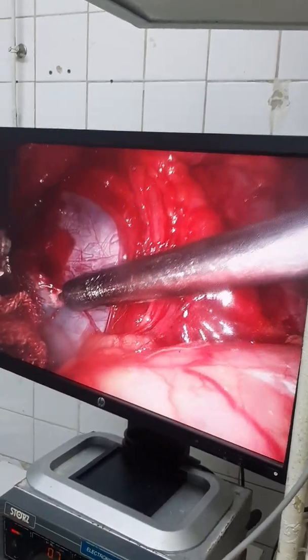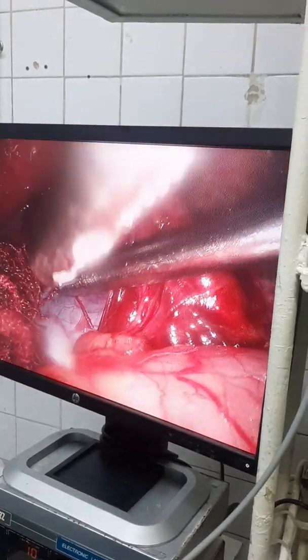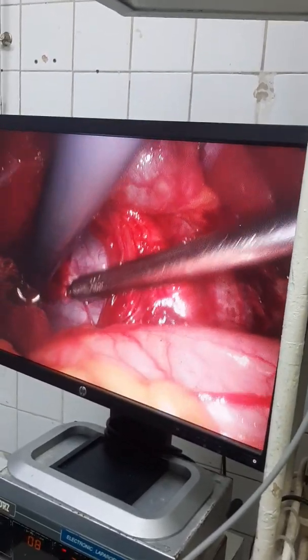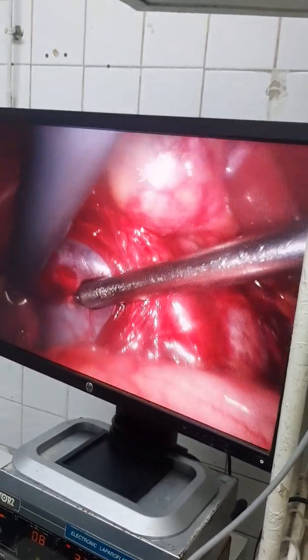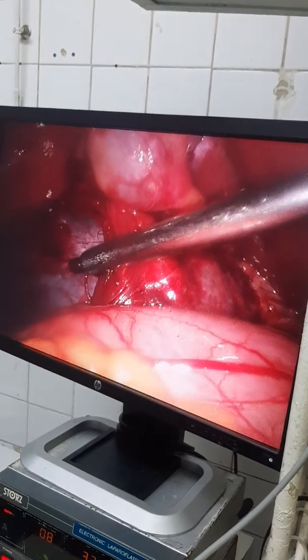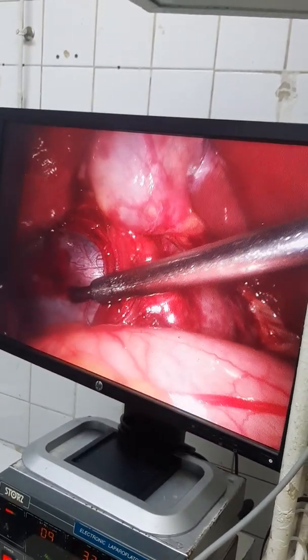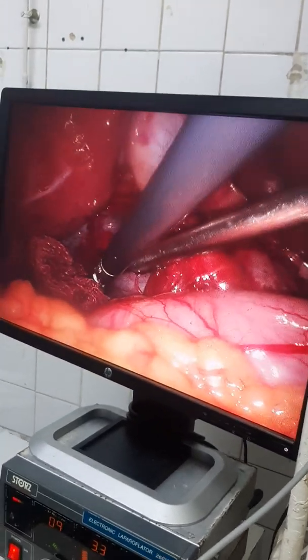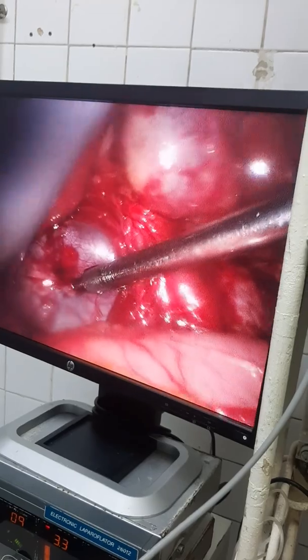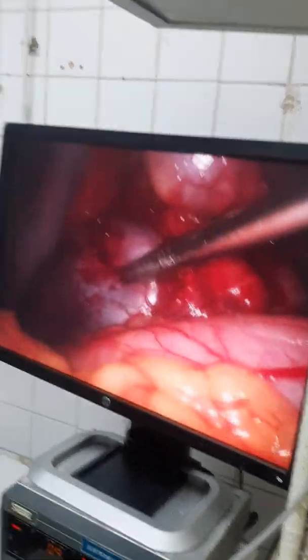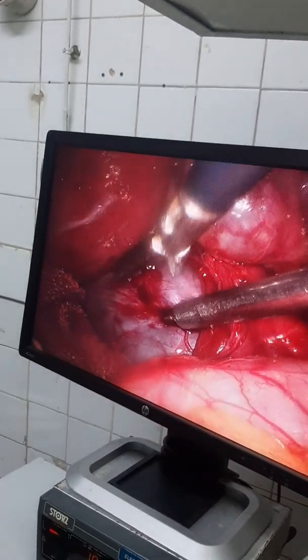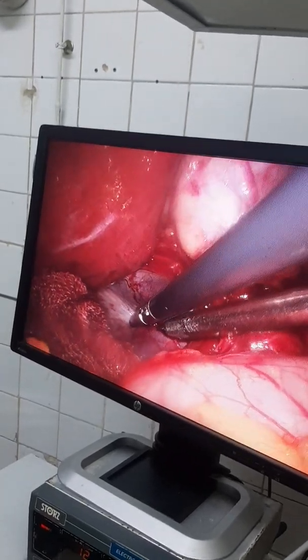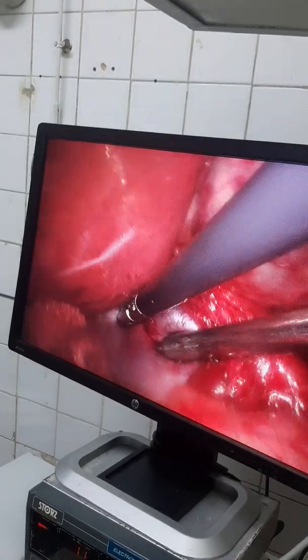Yes, we can see the suction here — it is clear. Alhamdulillah. This is decompressing slowly. The cyst is decompressed slowly; it is a huge cyst because it extends into the liver — the cyst is more than 10 cm.